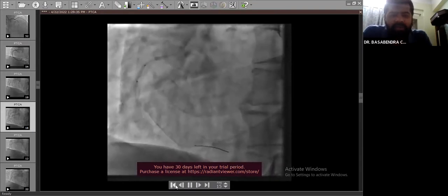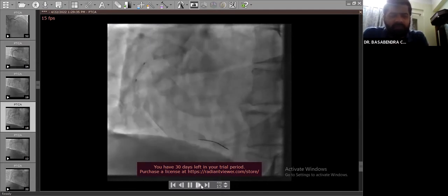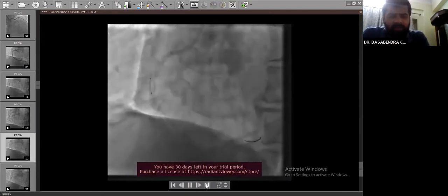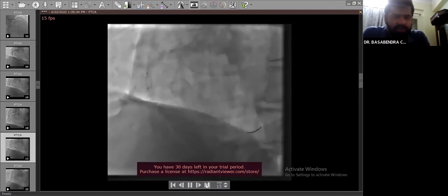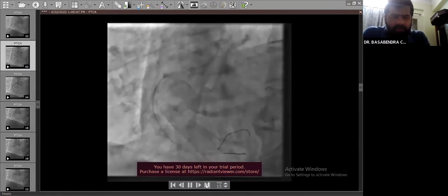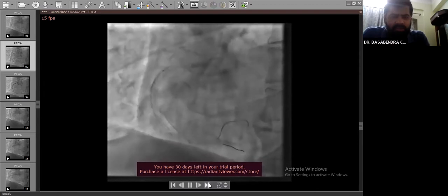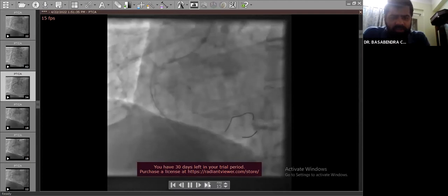So first we had taken a 2x10, 2x12 semi-compliant balloon. We could not cross the distal lesion. So we inflated the balloon at the mid and proximal levels and came out and decided to take a 1.5 into 10 balloon. But with this balloon also, we could not cross the distal most tight stenosis, the calcific lesion. A buddy wire was taken, a Whisper Extra Support wire was taken, but that also did not help. We could not negotiate through to the distal lesion.